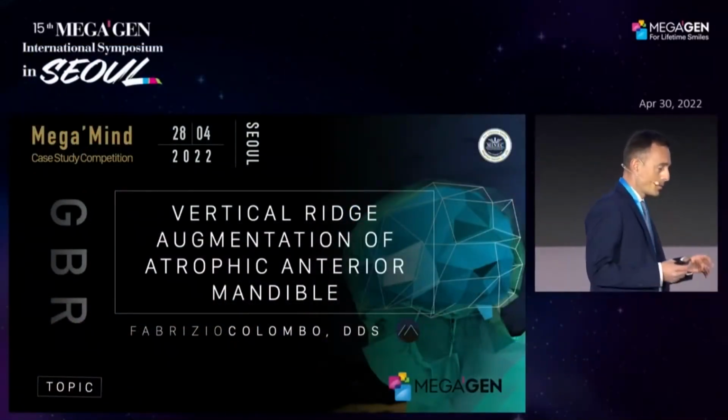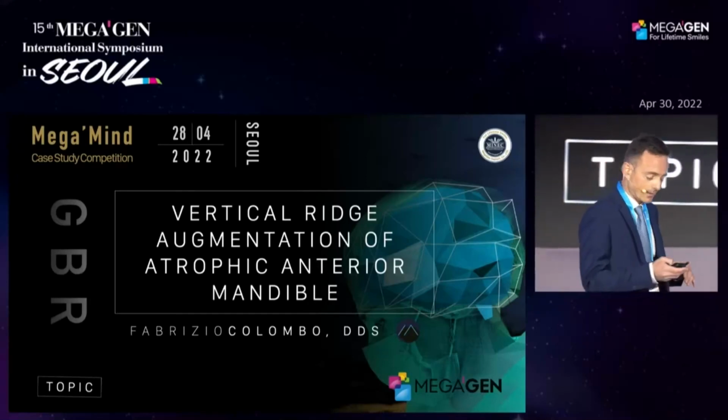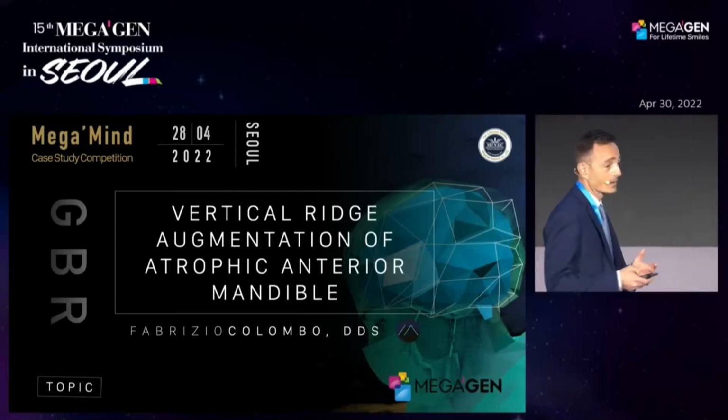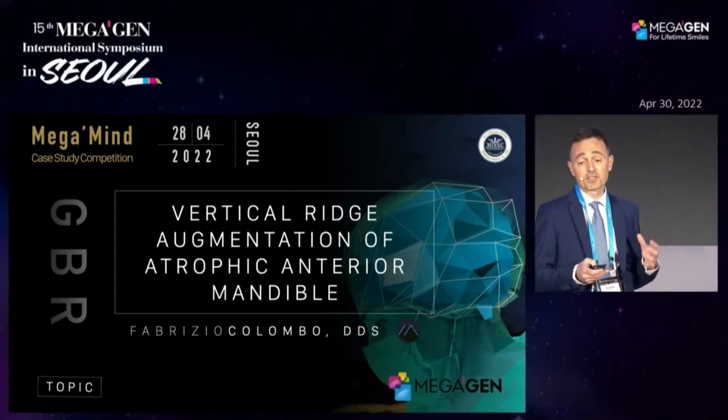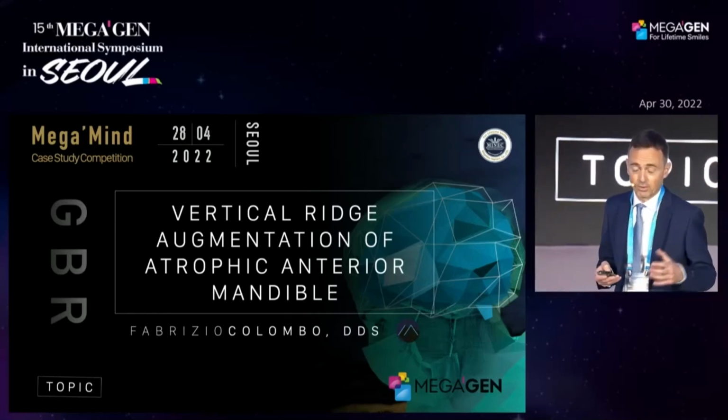So we have just 15 minutes, so I would like to go straight to the point, and I would like to introduce my clinical case. The title of my presentation is Vertical Ridge Augmentation of Atrophic Anterior Mandible.